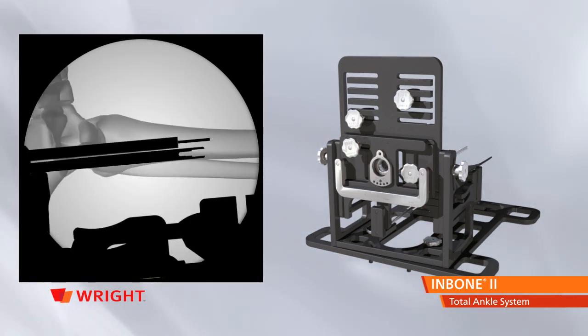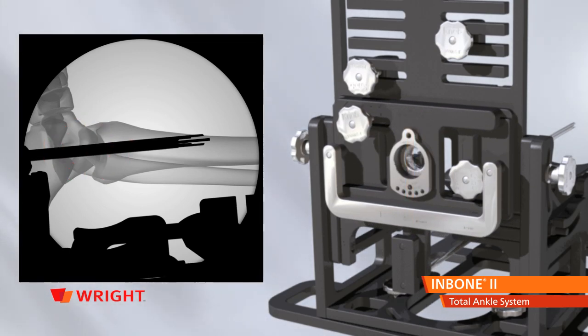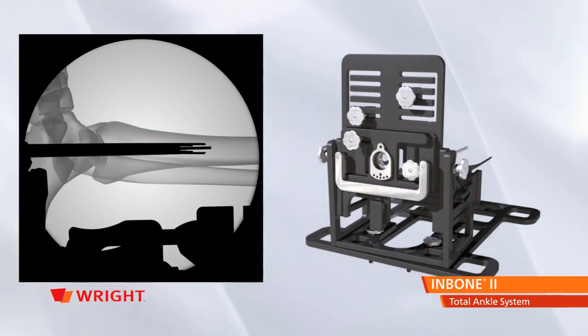Rotate the C-arm to the lateral view and adjust the guide rods under fluoro. Move the AP plate to align the ML rods on the center of the talus. Then move the foot plate, which controls plantar or dorsiflexion, to align the rods in the center of the tibia, verifying each movement with fluoro.